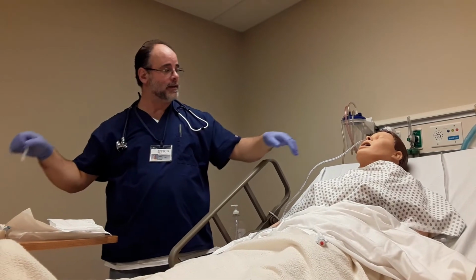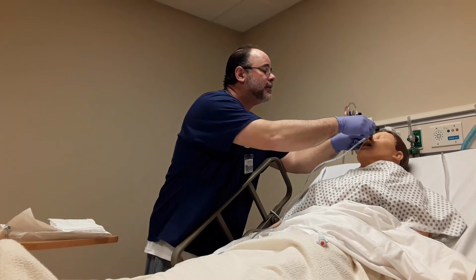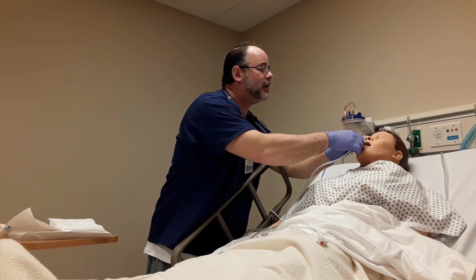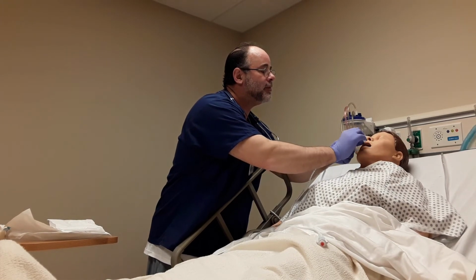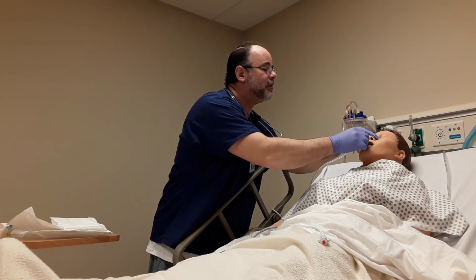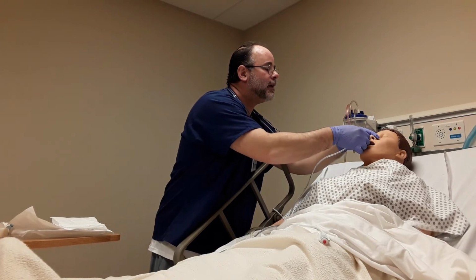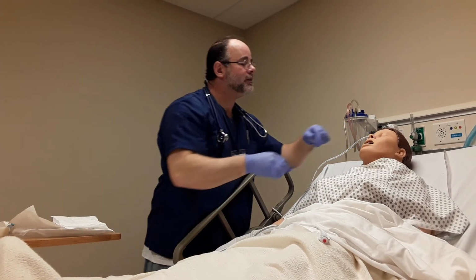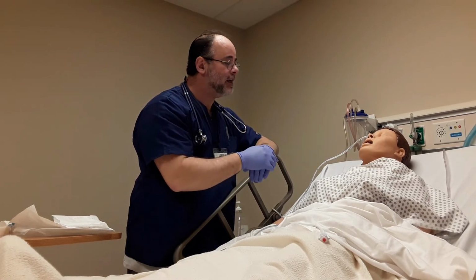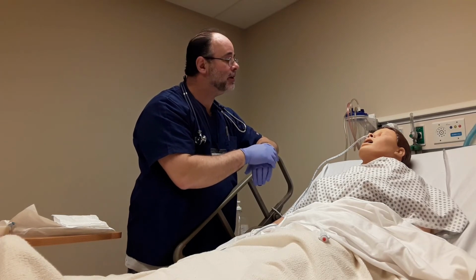Okay, once we've done that, I like to gently place the tape on now. Some literature is saying that it might be good to do that a little bit later, but I know from doing this, I can, in my documentation, say that there wasn't any coiling, that the patient didn't have any dyspnea, redness in the face, hoarse voice, wasn't trying to physically stop me from placing the tube. It was a well-tolerated procedure.